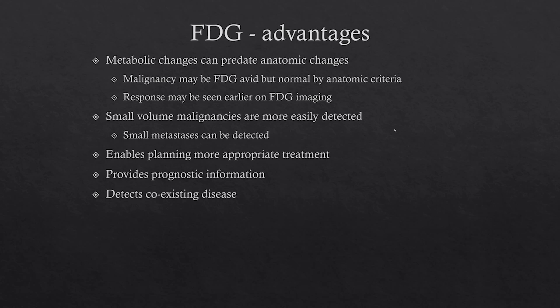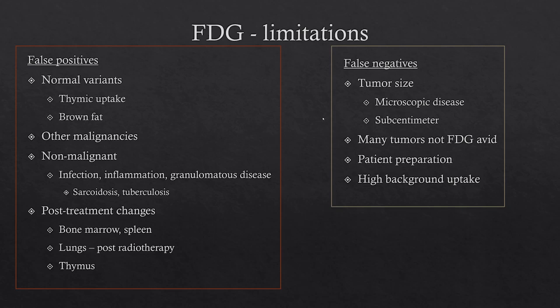It can help by allowing the clinicians to plan more appropriate treatment. It can also provide prognostic information based on the amount of uptake. It can also detect coexisting disease in the patient. Now, FDG does have its limitations. It can have false positives and false negatives.